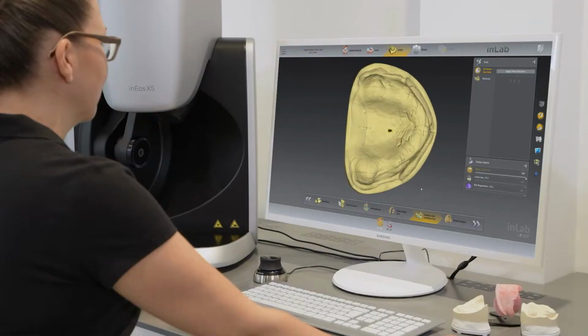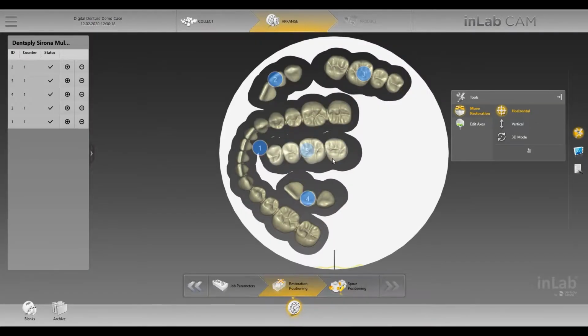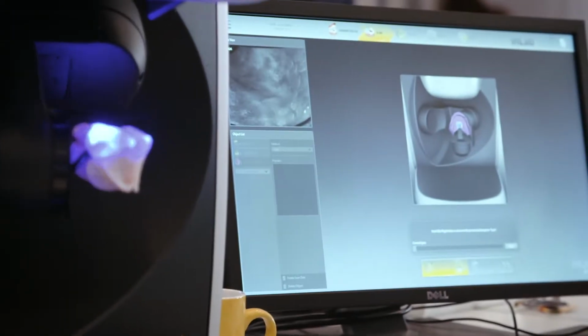In terms of the current workflow, if any existing workflow you have, we basically just start digitizing things once we get all the information in the lab. But then you have the digital workflows, and that is a huge benefit because it's more on the comfort side of the patient.